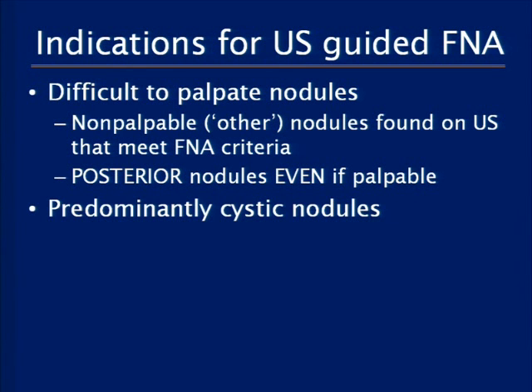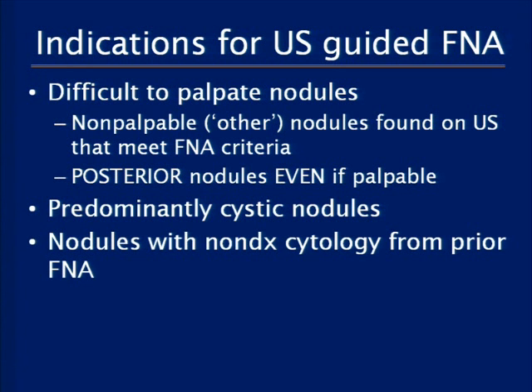Nodules that are predominantly cystic but may have some solid component, you really need the ultrasound to guide you in doing a biopsy. If you just stick the needle in by palpation, you're more likely to just be in the fluid component and not necessarily going to be in the solid component.